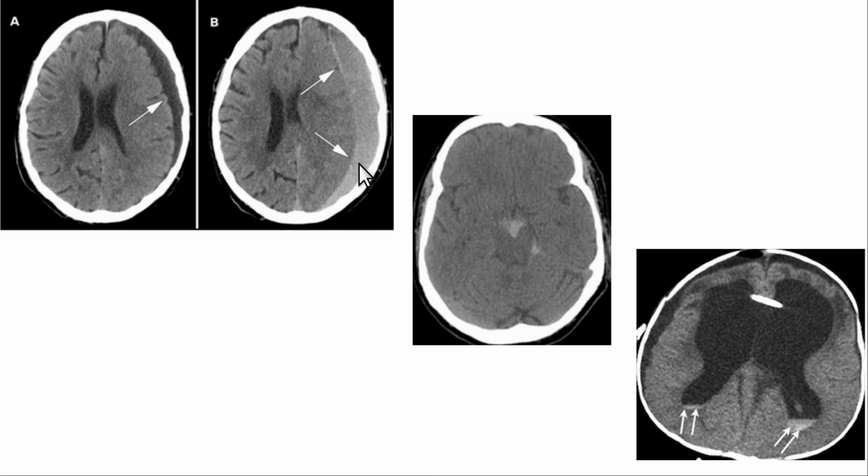Okay, when patients are demented, we get head CTs to see if they've got something like a subdural hematoma that can be drained or a meningioma tumor that can be removed. But I can tell you that's super, super rare. Almost always, I don't see anything significant. The vast majority of head CTs have no significant findings on them, maybe as many as 29 out of 30, more than 95%. They're usually nothing but chronic atherosclerotic disease, okay?